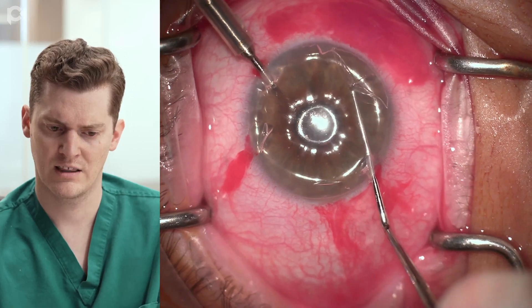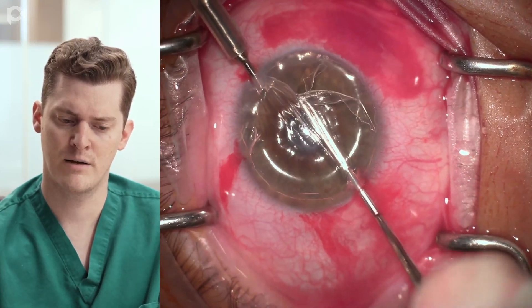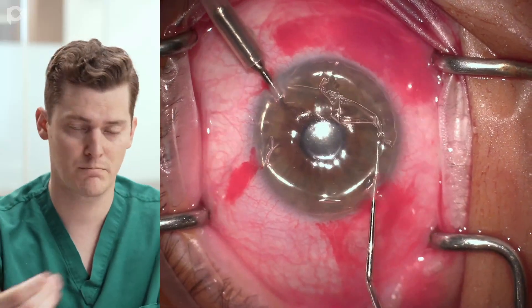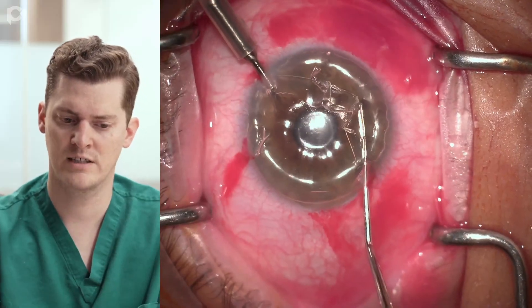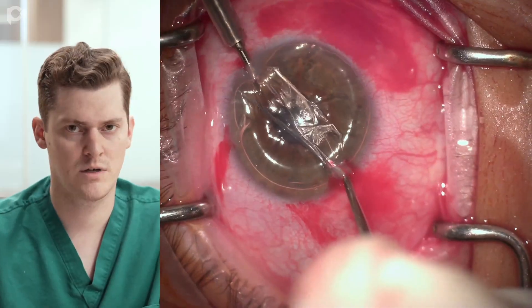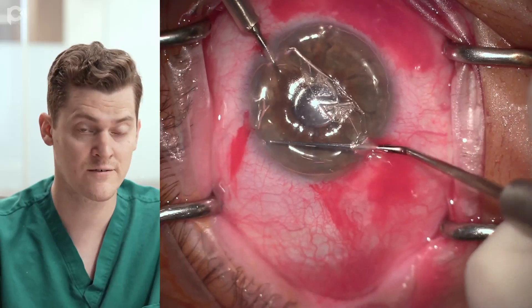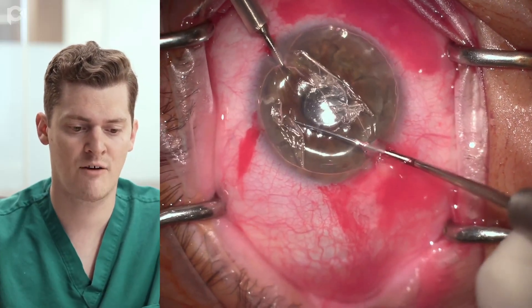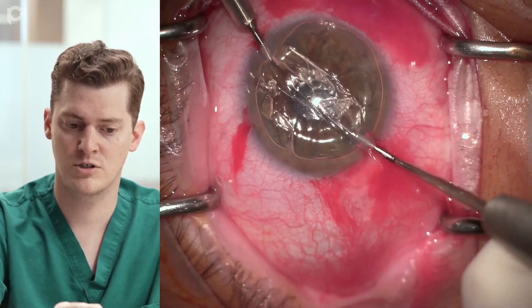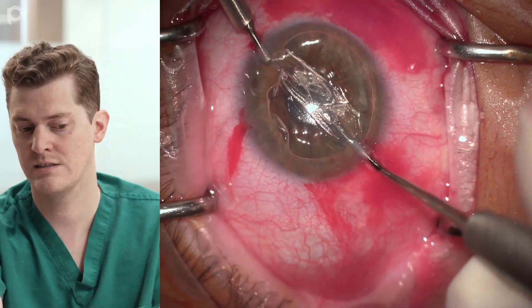Starting out laterally, pulling in a gentle motion and really trying to make smooth movements — not teasing or pawing at it, just gently pulling in as few motions as possible. Really taking what is given to me: not doing anything in a premeditated, systematic way, but whatever the descemetorhexis gives me is what I'm going to take so it comes off more easily. You'll see areas where I'm not getting it easily, so I just move to a different area where it comes off easily.